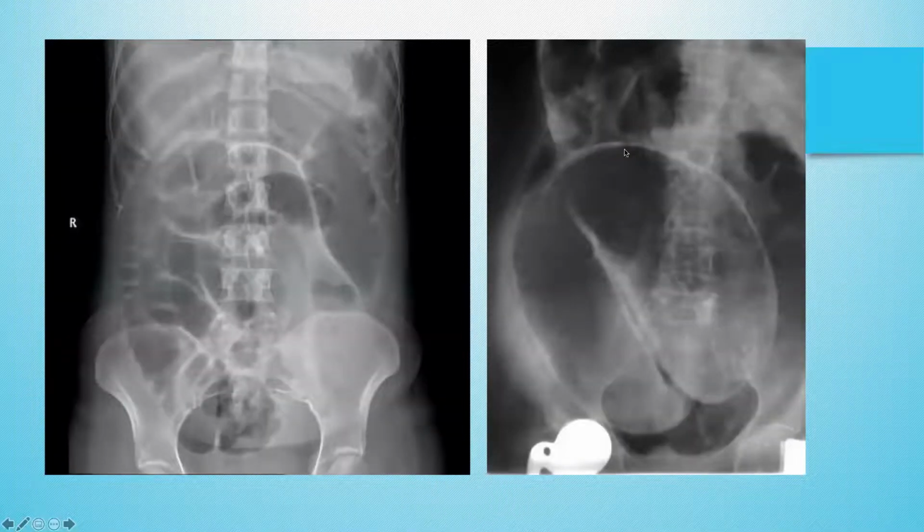Right. So here we have some more bowel obstruction. And here we actually have some large bowel. And the large bowel looks different from the small bowel because now you're getting haustra, which are interrupted, as opposed to the valvulae conniventes that you see in the small bowel. And you're all supposed to have learned that very well as medical students.